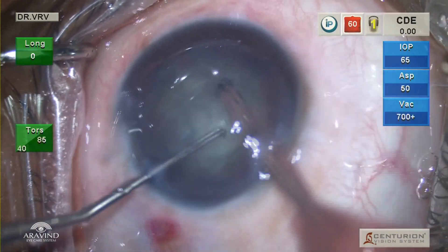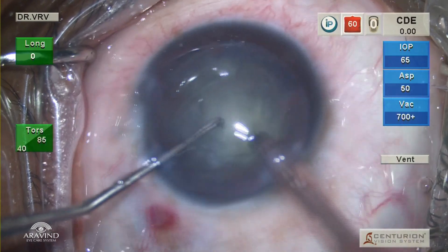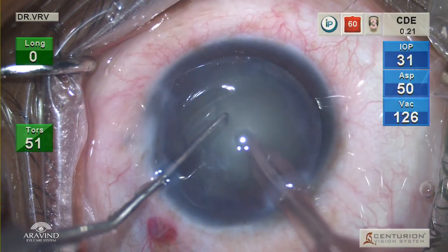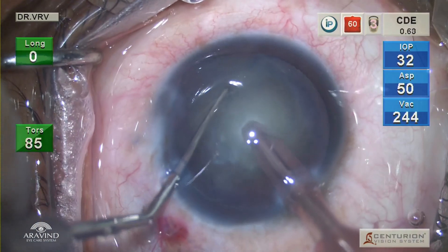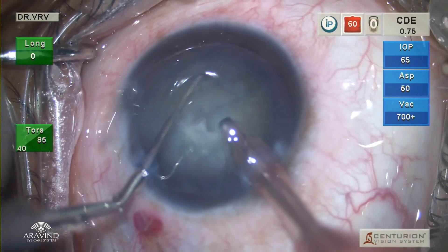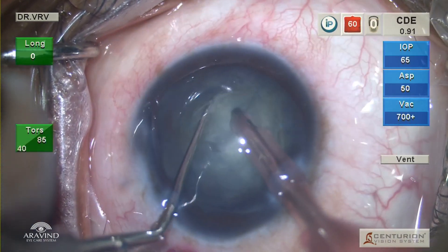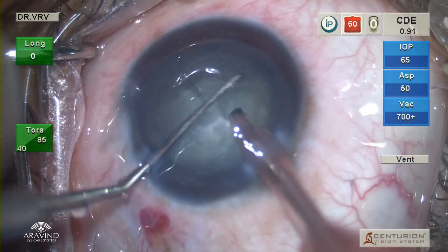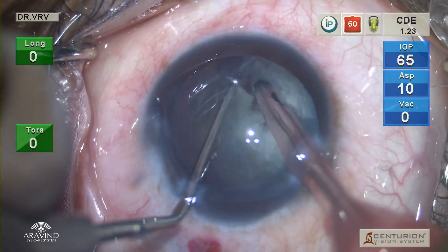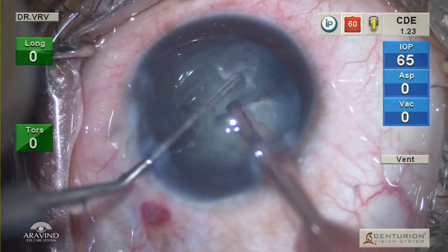First, the cortex and epinucleus above the endonucleus is removed, and then the phaco probe is buried in the center and vertical chopping of the nucleus is done. The nucleus is a little bit hard, though it is very small, so I prefer to use a direct chop technique. In traumatic cataracts with zonular dehiscence, it is always better to avoid a divide-and-conquer or stop-and-chop technique as they both can worsen the zonular dehiscence.